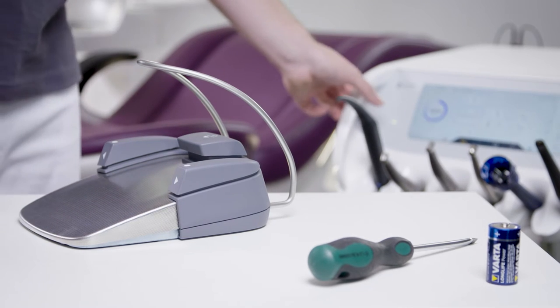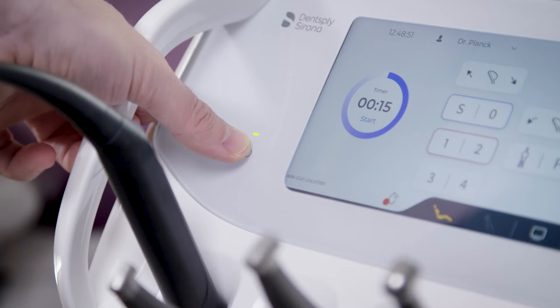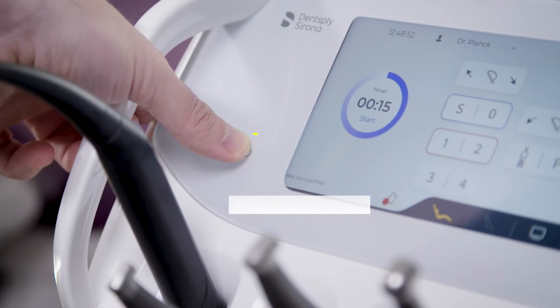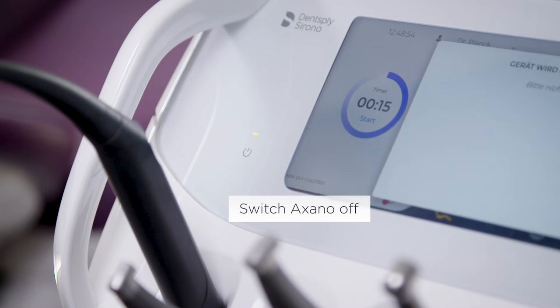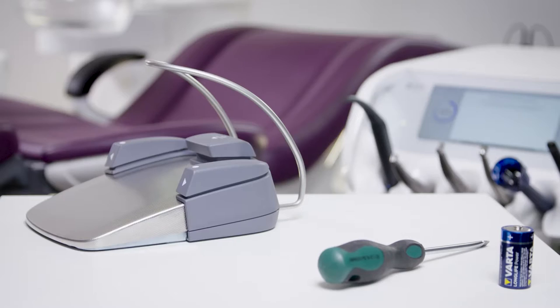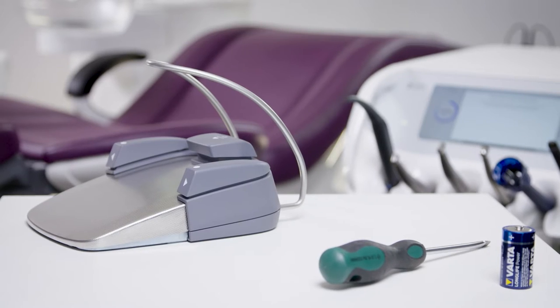Switch Axano off at the standby switch before replacing the battery, so you do not inadvertently trigger any functions.